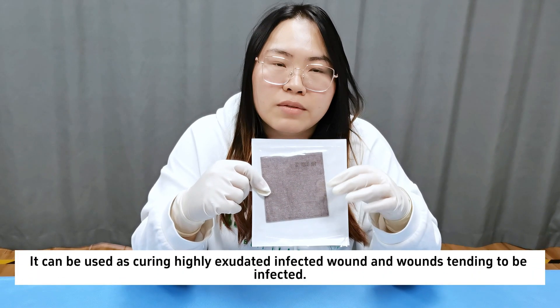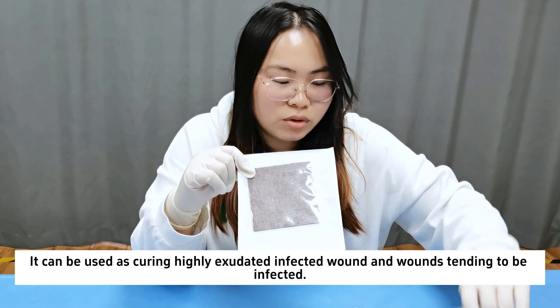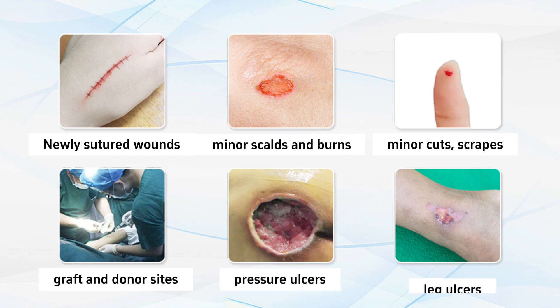It can be used for highly exudated infected wounds and wounds tending to be infected, including newly sutured wounds, minor scalds and burns, minor cut scrapes, graft and donor sites, pressure ulcers, and leg ulcers.